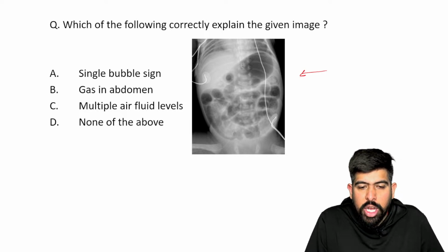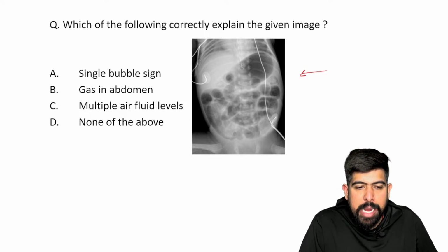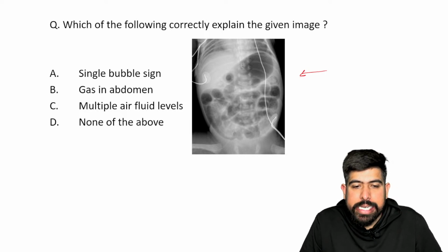So what will be your answers? Please reply to me in the chat box. What will be your answers? The options are clearly given to you, and of course, this is also your erect X-ray. Yes, an erect abdomen X-ray is given to you in this condition.